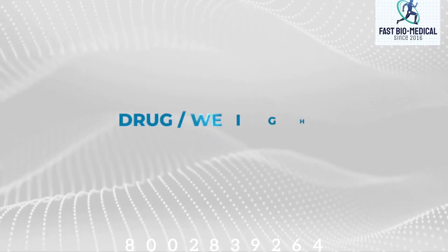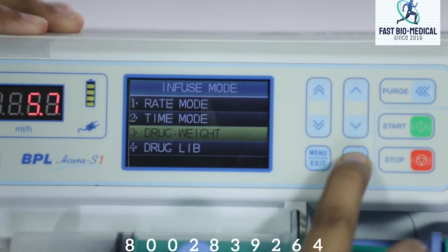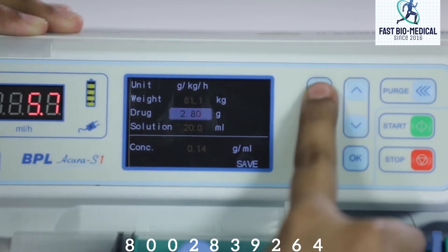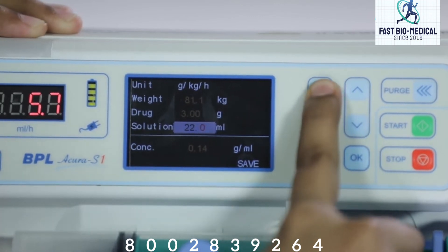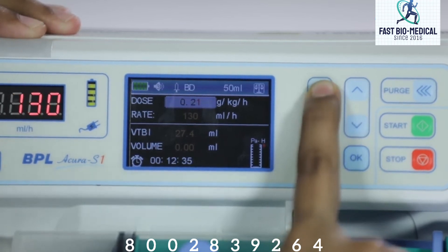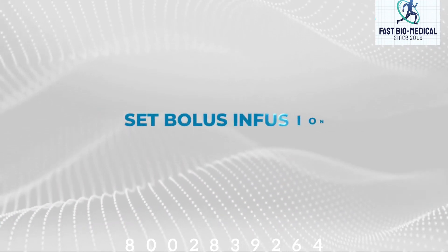Drug or weight mode: in running mode, select drug or weight mode and confirm. The system will enter the unit selection screen — there are seven selectable infusion units; select the desired unit and confirm. Adjust the drug amount, solution volume, and body weight respectively, and the solution concentration shows automatically. After these three parameters are set, the cursor moves to C. Press OK to enter the drug weight syringe interface, adjust the drug dose, and the flow rate shows automatically. After all parameters are confirmed, press start to begin injection.